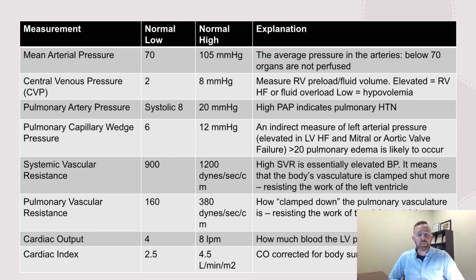All right, and then next would be pulmonary artery pressure. So it's measuring essentially a blood pressure, but inside of the pulmonary circulation. When you measure blood pressure with your cuff, you're measuring systemic circulation, right? So that's measuring a lot of the left side of the heart values, right? Well, the pulmonary circulation is perfused, of course, by the right ventricle, the right side of the heart. So we can do the same thing with this catheter. We can actually measure the pressure inside of that pulmonary circulation.